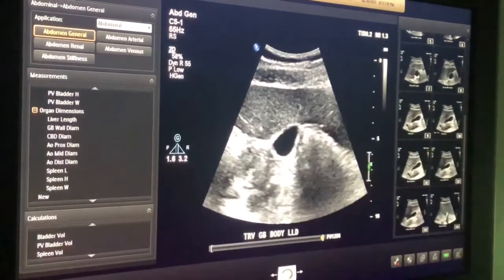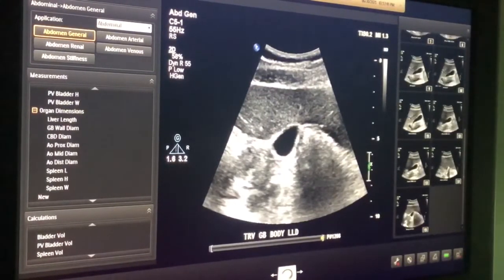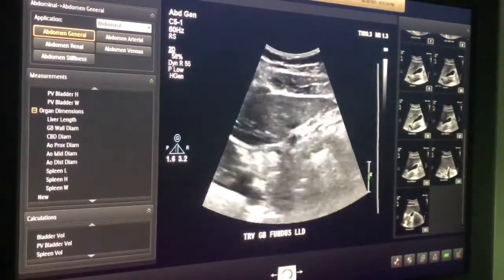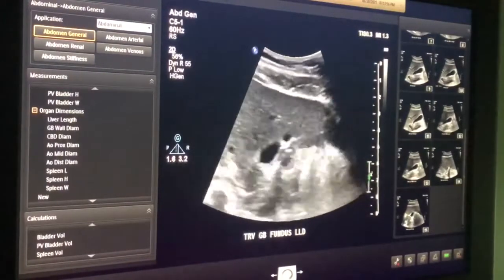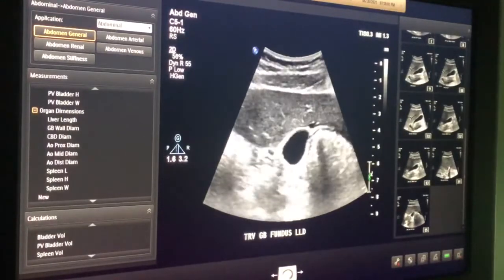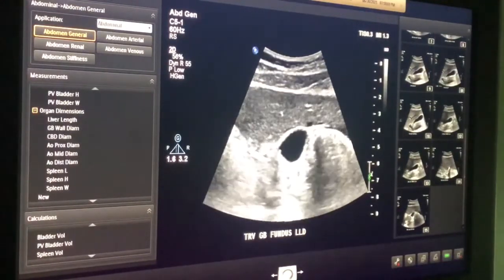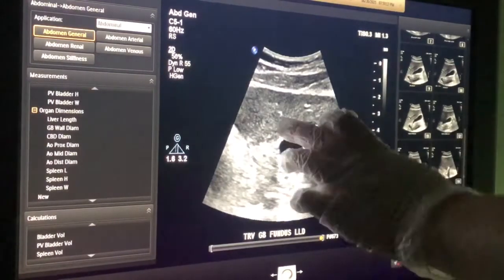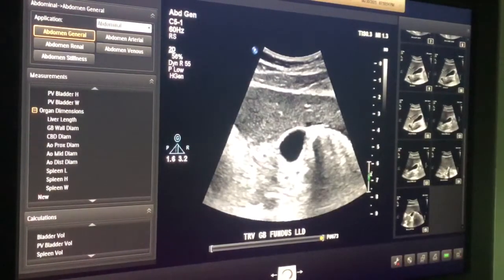Here's the body right before the fundus. I'm going to take that. Next will be the fundus. I'm going to have the patient take a deep breath in again, please. Following that bad boy out. Okay, it ends there, so I'm going to take it here. Breathe, patient. So the walls all the way around it look clear, no internal echoes.